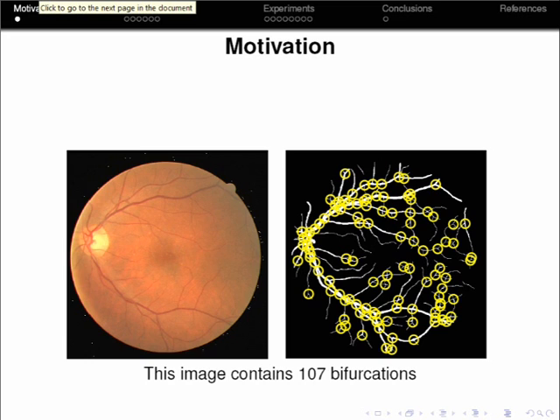The figure on the right shows the ground truth of all vascular bifurcations in this retina image which consists of 107 bifurcations.